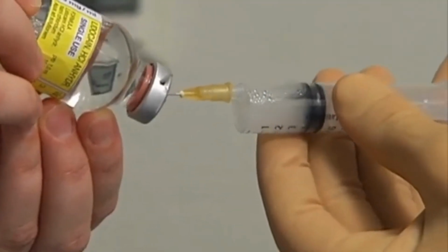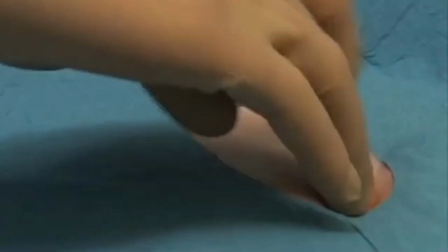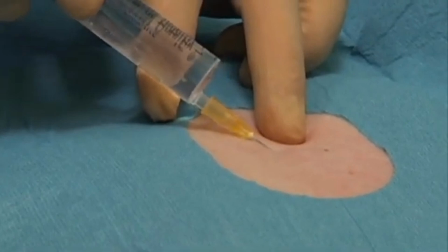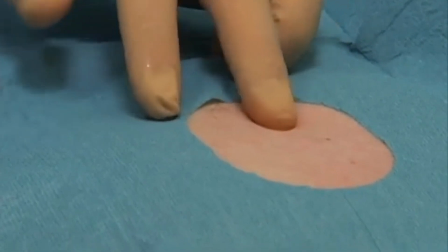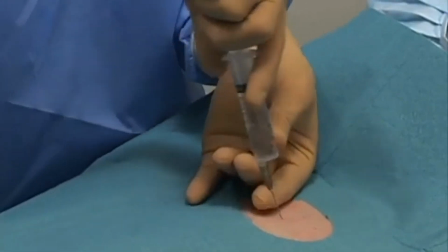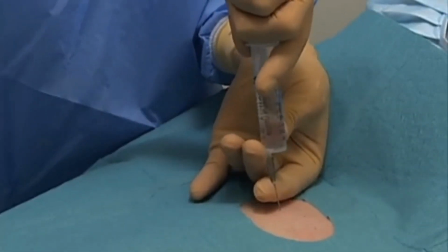Aspirate lidocaine into the 10 milliliter syringe for use as a local anesthetic agent using a 25-gauge needle. Inject a wheal of lidocaine at the superior edge of the third rib at the midclavicular line. Switch to a 22-gauge needle and anesthetize the deeper layers of tissue by inserting the needle at an angle perpendicular to the skin. Before injecting the anesthetic, always aspirate the site to make sure the needle has not entered a blood vessel.